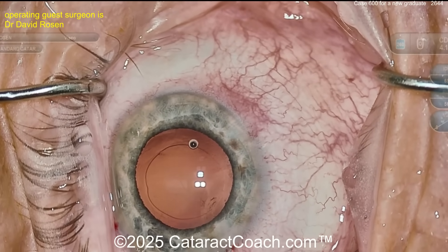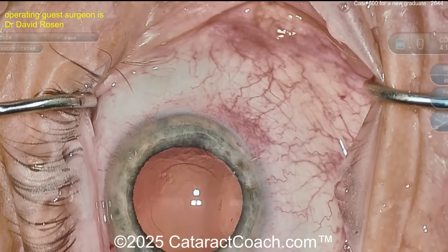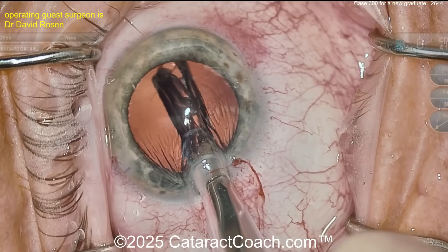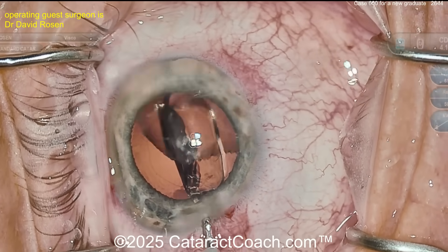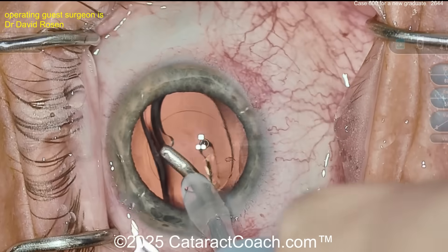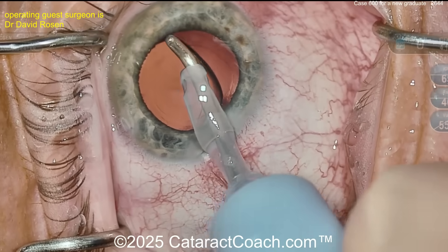You may want to steal a trick from me: I push the rhexis slightly nasal so when I center it up there's a little more nasal coverage — think about where the pupil is, a little more nasal. The temporal limbus is furthest from the visual axis. Here comes the lens going inside the eye — deliver, deliver, deliver. Looks like a two-handed injector with a single-piece acrylic lens. Get it opened up and placed in the capsule bag — that's a good looking rhexis, probably a perfect five millimeter rhexis with a six millimeter optic. Take out that viscoelastic; I like to go behind the optic, and get those haptics to open up. Lens in good orientation.